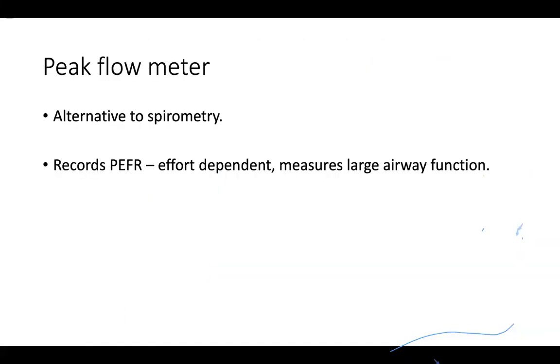So unlike spirometry, we only look at the short expiratory blast, which I already mentioned. Since spirometry is usually recommended for about 6 years of age and this is a simpler method, we can also give it to children between 4 and 6 years. And we can also look at some personal best values and then determine how they are performing.